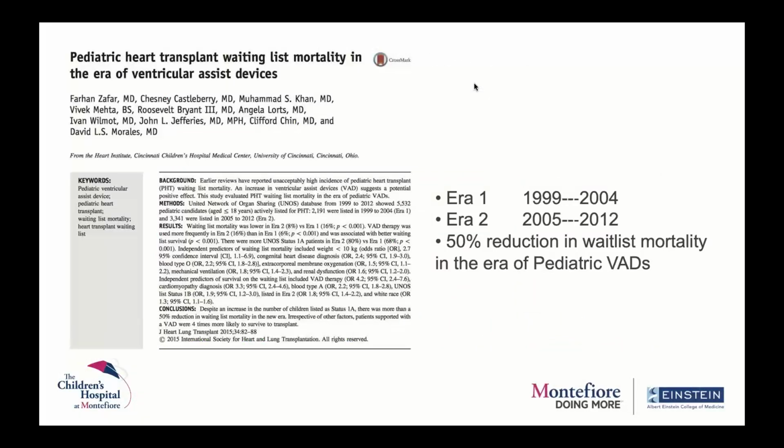This is a paper that looked at two eras, 1999 to 2004, and compared it to era two, which was 2005 to 2012. We consider the second era to be an era of pediatric ventricular assist devices. And in the current era, we saw a 50% reduction in waitlist mortality, which is considered the era of pediatric VADs.